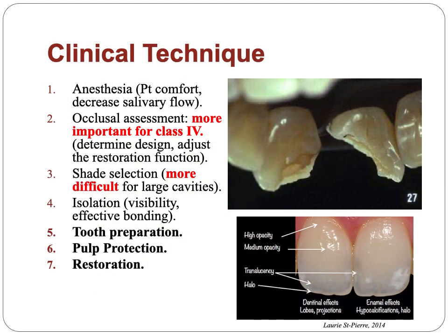Clinical technique for any cavity preparation that we need to restore in the clinic. We start with giving anesthesia so that we can guarantee a patient comfort and decrease the salivary flow. Then after that we need to do our occlusal assessment.